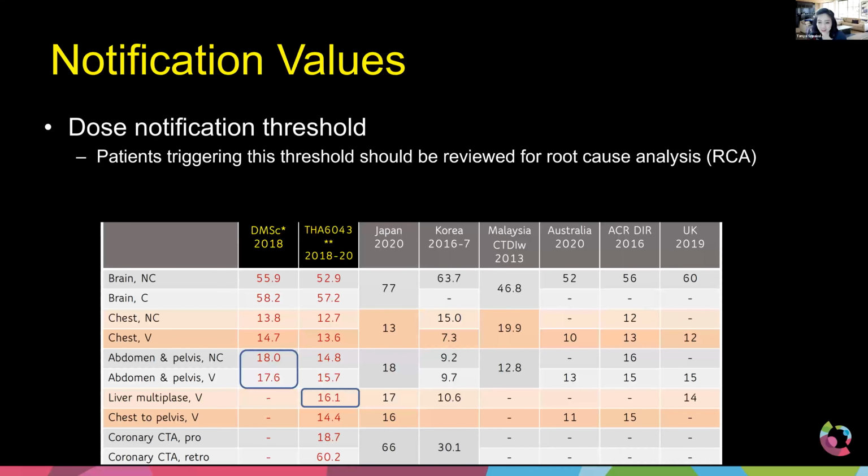So we still need more data. Yeah, that's true. I think that when starting prospective, do not fixate on about 20 or 18. Because from 60, if you can go down to 30, that is great enough. So don't use this as the target.